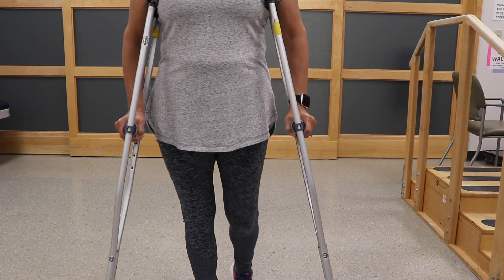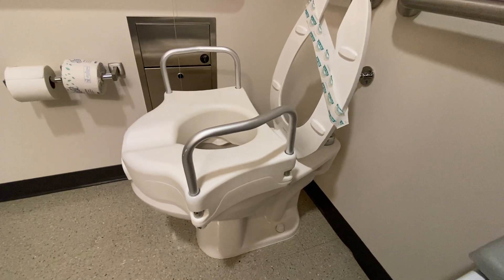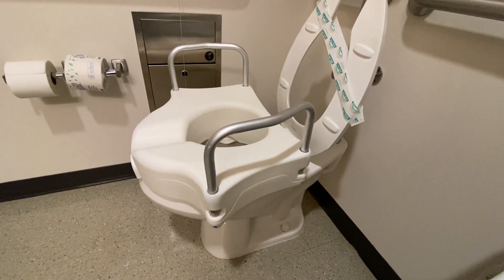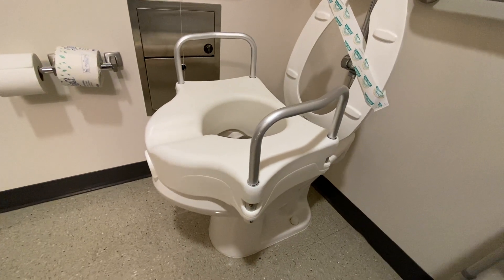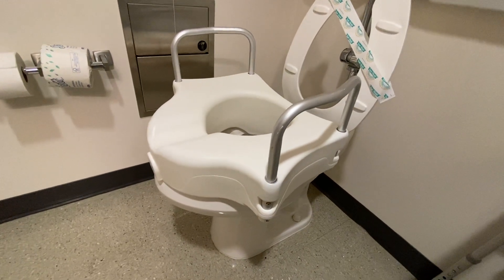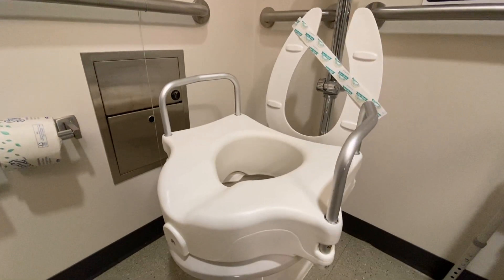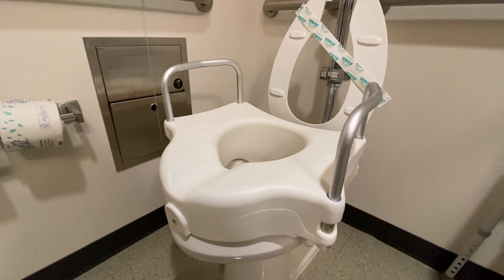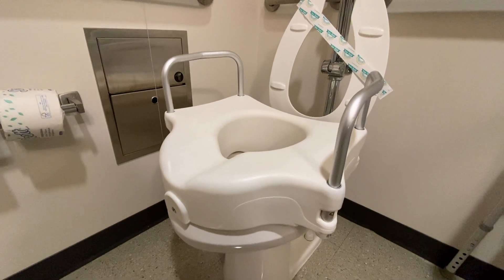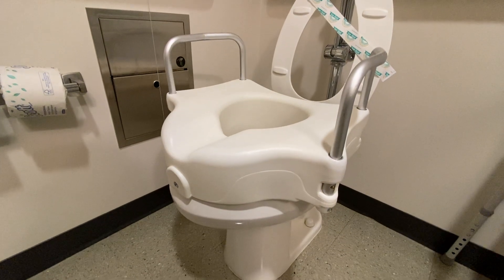If you are five foot three or taller and have a standard size toilet, you may need an elevated toilet seat. These seats come with or without handlebars. You will need a seat with handlebars if you don't have a countertop you can push up from or a grab bar you can hold on to when getting off the toilet. Make sure you check to see if you have a round or oval toilet before buying your elevated toilet seat.